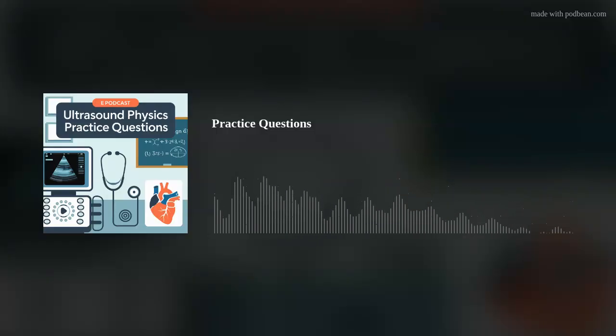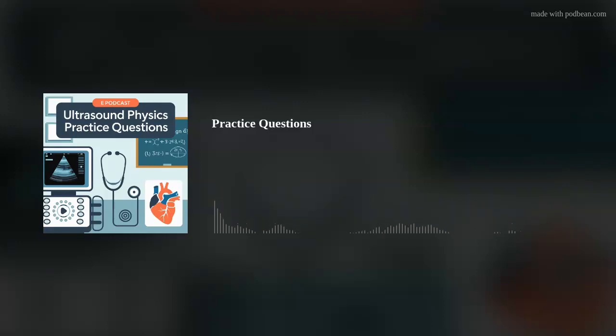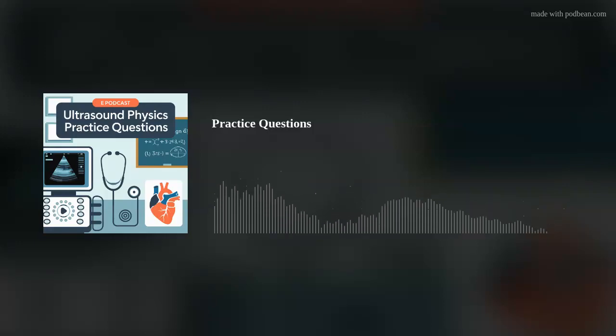Exactly. B mode lets us see the anatomy based on how echogenic the different tissues are. Bright areas are things that reflect sound waves really well, like bone or dense tissue. Darker areas are things that absorb more sound energy or don't reflect it as well, like fluid-filled spaces. This is starting to make so much sense. Okay, quick one. What's the common name for lead zirconate titanate? PZT. Right. The wonder material that makes transducers work.